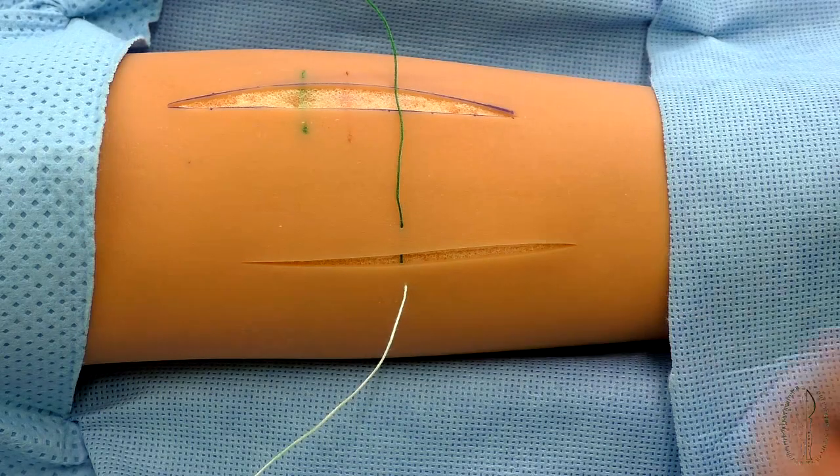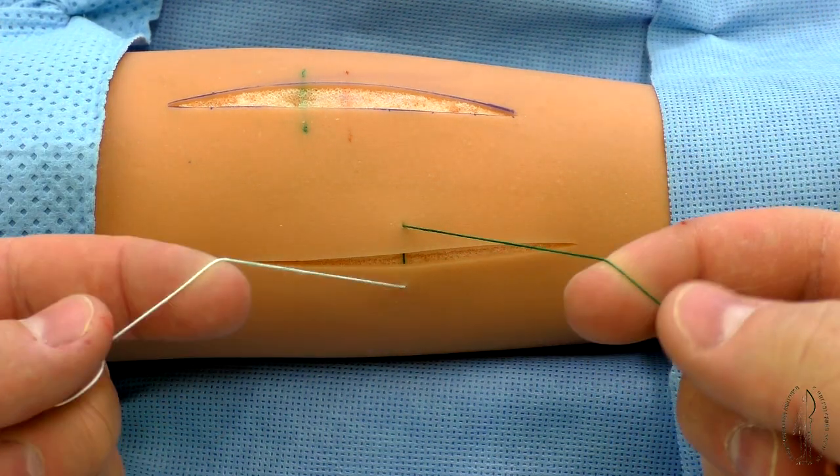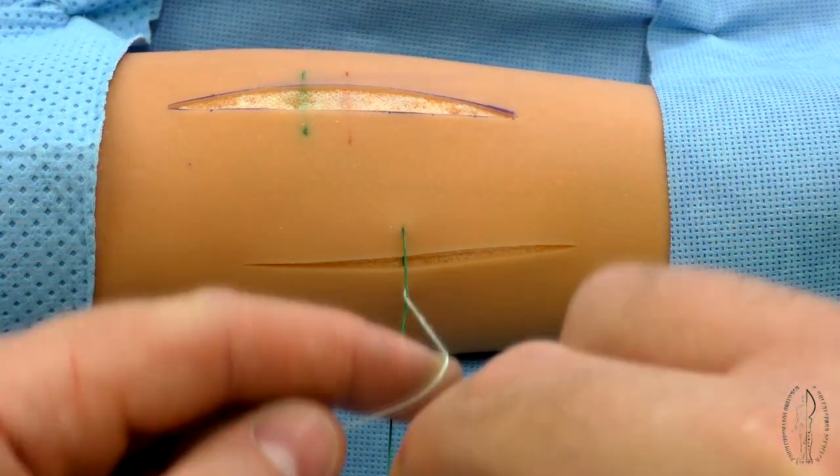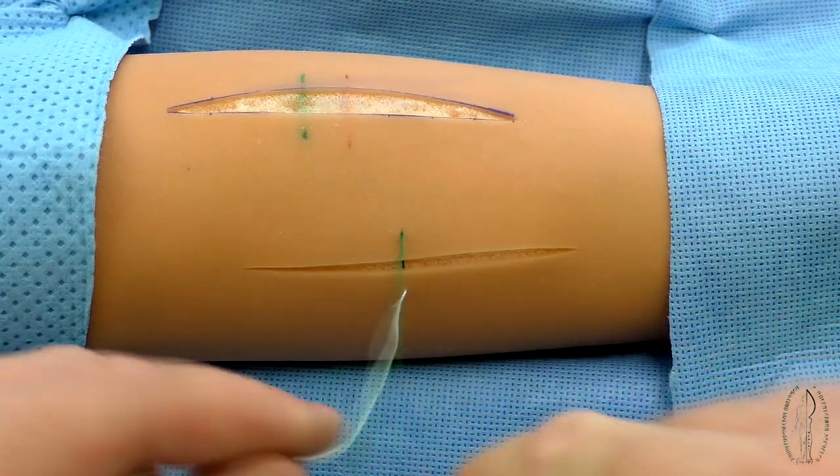The simple knot consists of several loops, not less than two, successively tightened. If filaments have wrong position in hands, their double or cross can occur.